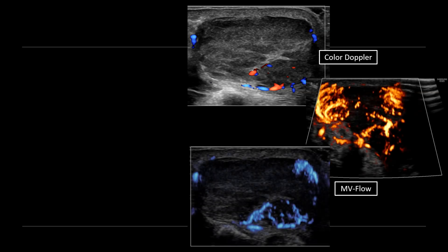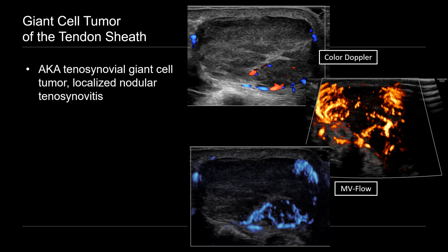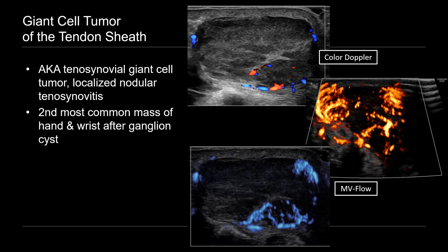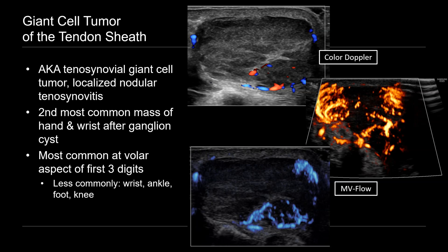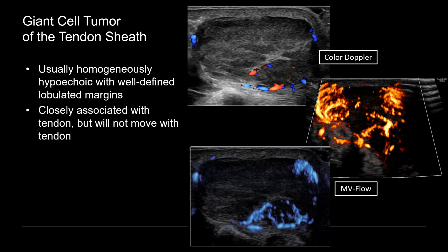We can further bring that out by adding MV flow, which is a form of microvascular flow imaging that detects slow flow in small caliber vessels, so it's a great way to bring out the vascular characteristics. So we have a solid vascular mass. At surgery, this proved to be a giant cell tumor of the tendon sheath. These are also known as tenosynovial giant cell tumors or even localized nodular tenosynovitis, and they represent the second most common mass of the hand and wrist after the ganglion cyst. They occur most commonly at the volar aspect of the first three digits — the thumb, index finger, and middle finger — but we can also see them at the hand, wrist, ankle, foot, and knee. They're usually homogeneously hypoechoic with well-defined lobulated margins, and they'll be closely associated with the tendon but will not move with tendon movement because they arise from the sheath, not the tendon itself.